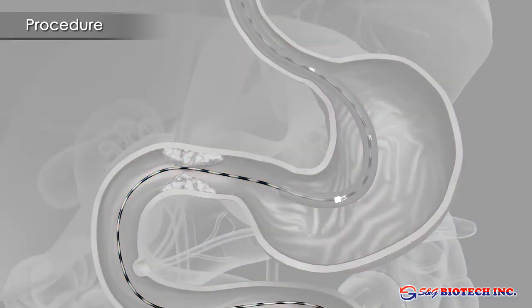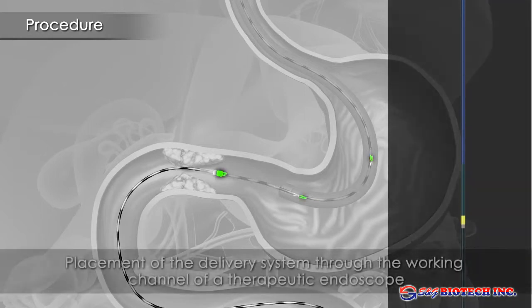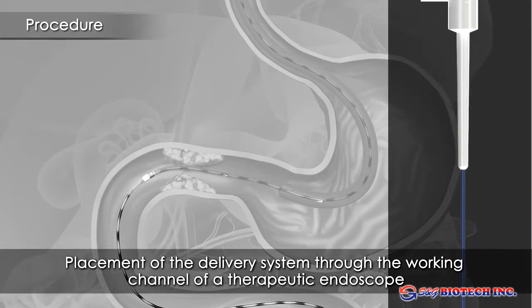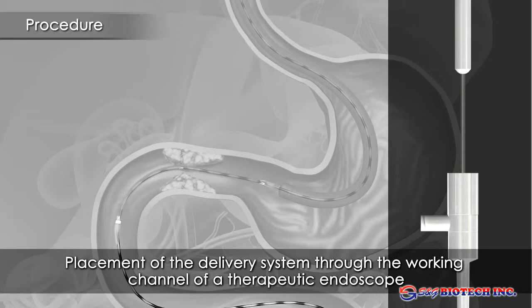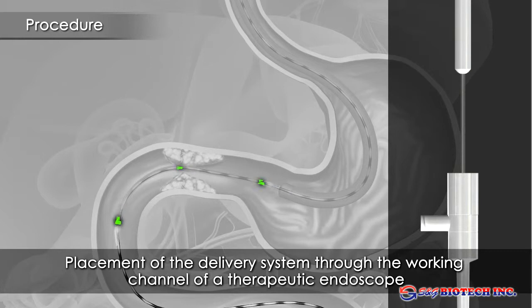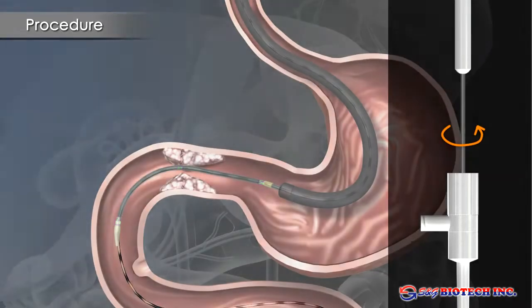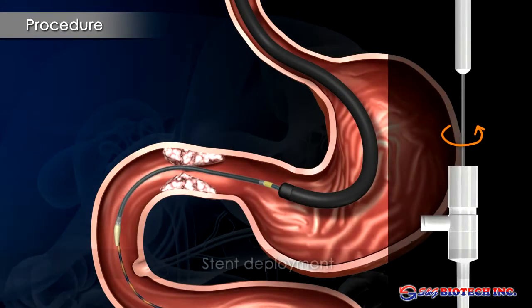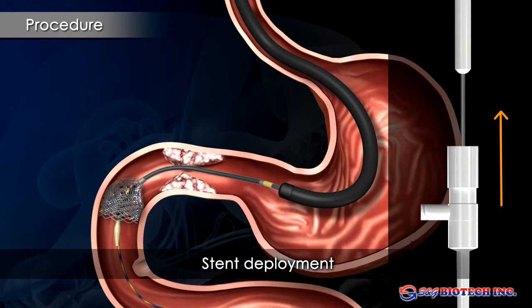The stent delivery system is advanced over an ERCP wire through the stricture, ideally through the large working channel. The stent is positioned across the tumor and should extend 1 to 2 cm beyond both ends of the stricture. The sheath is unlocked and withdrawn while stent position is confirmed under fluoroscopic control.